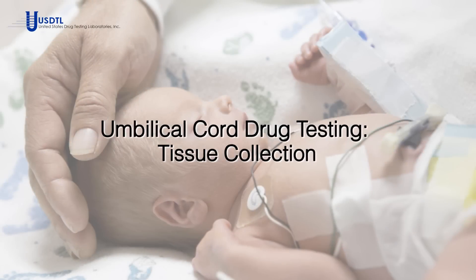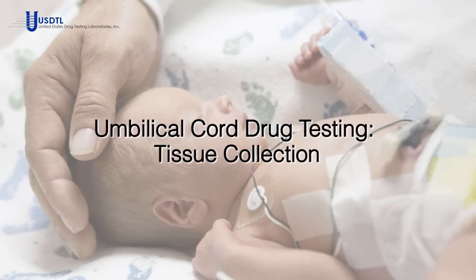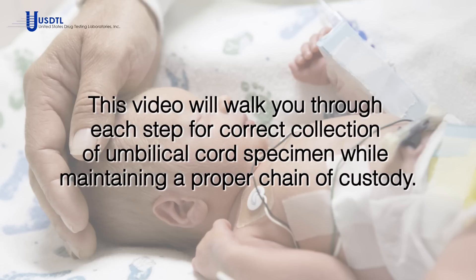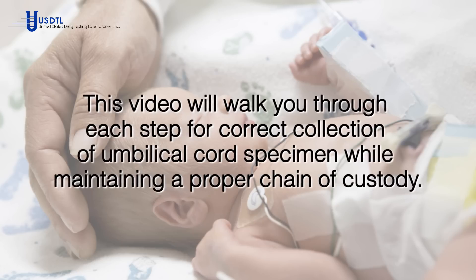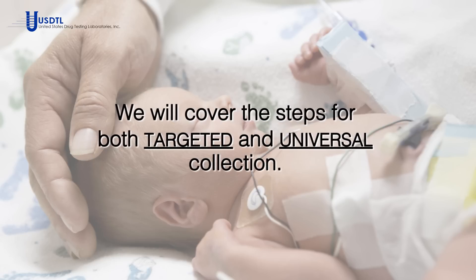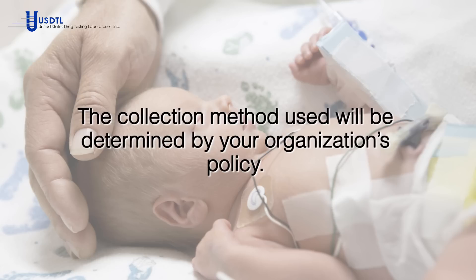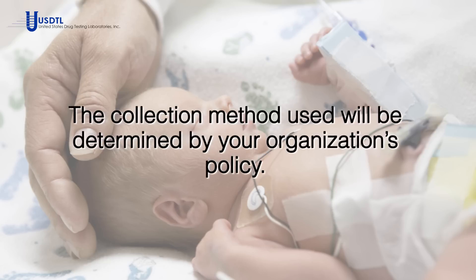Welcome to USDTL's umbilical cord drug testing tissue collection video. This video will walk you through each step for correct collection of an umbilical cord specimen while maintaining a proper chain of custody. We will cover the steps for both targeted and universal collection. The collection method used will be determined by your organization's policy.